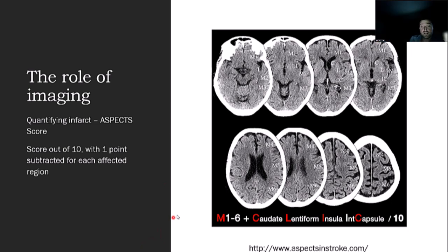So no, you would include them, because basically you're trying to quantify the amount of potentially salvageable brain. So you want to know how much brain is actually already infarcted. So if they had a giant, like say they had an aspects of 2 to begin with, you'd have to say there's an aspects of 2, but it's predominantly chronic ischemia. I would just qualify it with that.